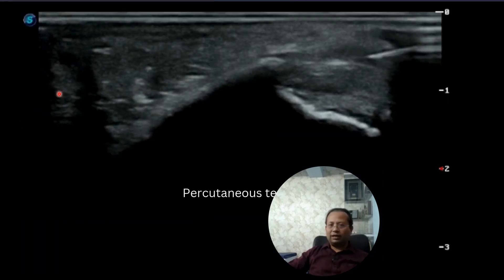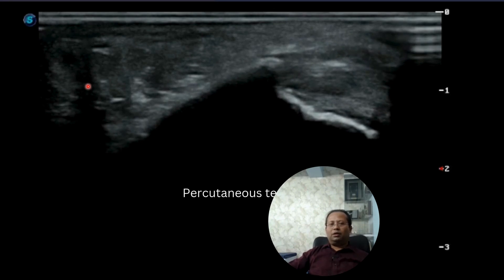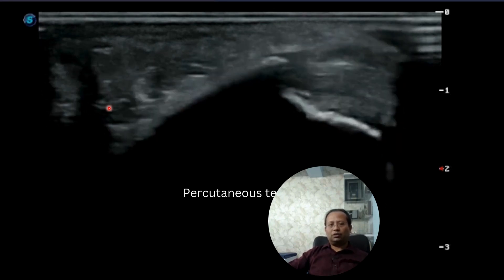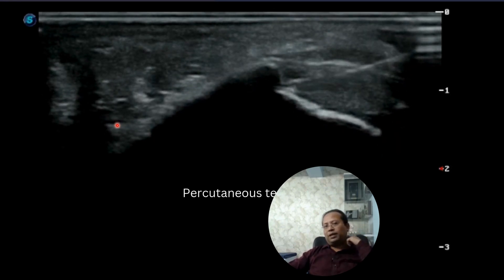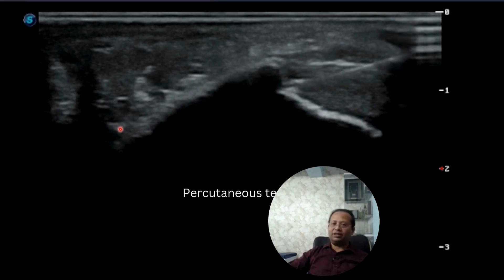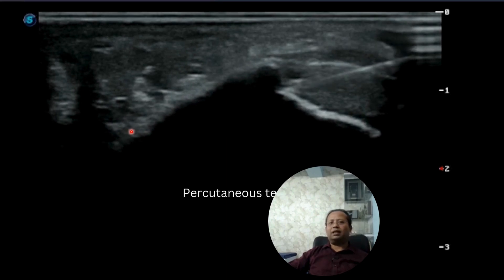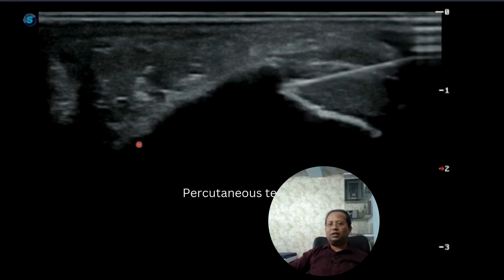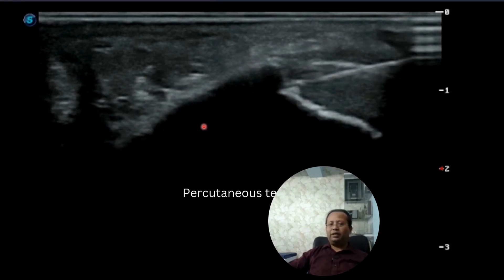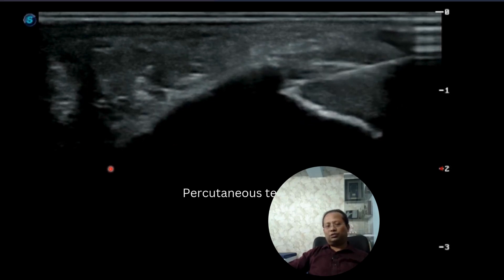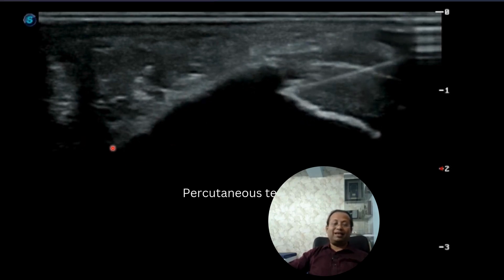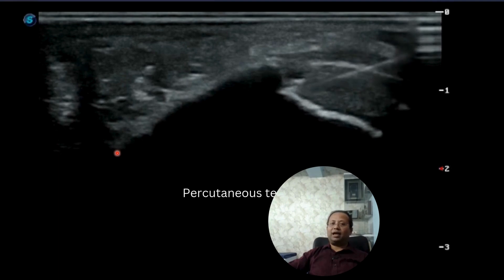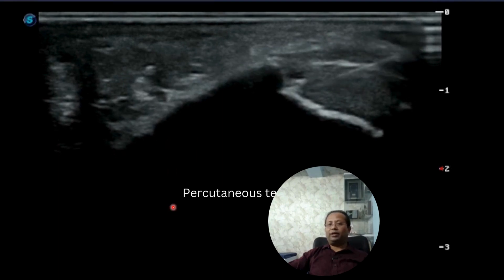The diagnosis of calcaneal bursitis is confirmed. Treatment depends on the presentation — this patient had an acute presentation and was acutely in pain, so we opted for peritendinous steroid infiltration and percutaneous needle tenotomy.